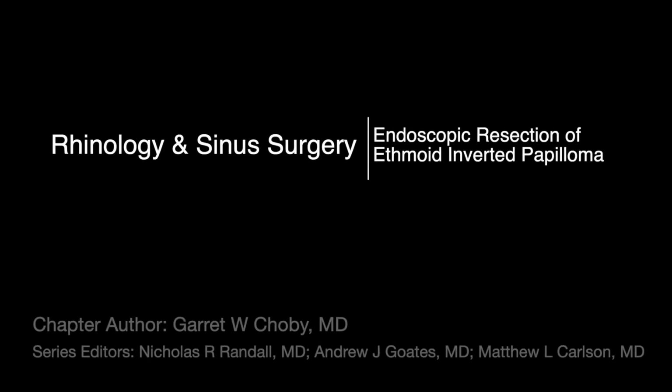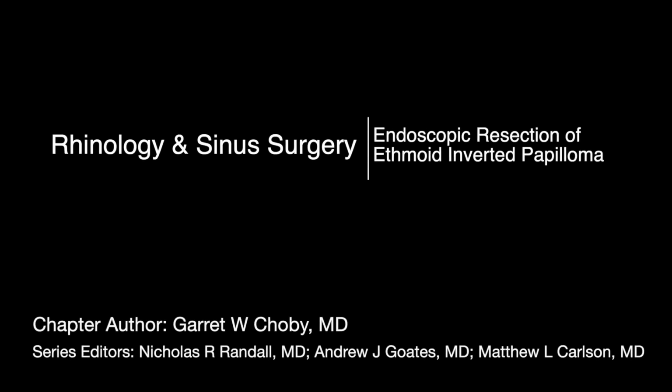Hello, this is Garret Choby, and today we will be discussing a case of a left-sided inverted papilloma with a primary attachment point in the left posterior ethmoid cavity.